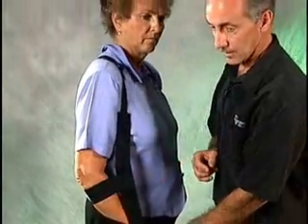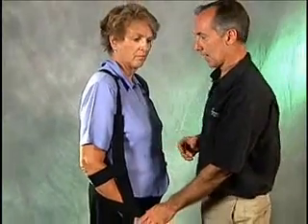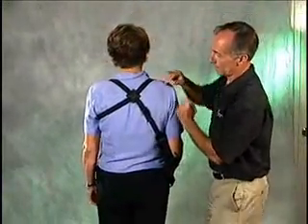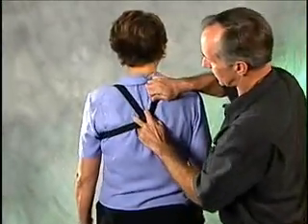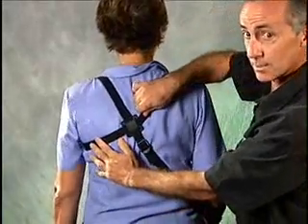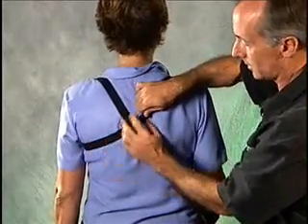You want to have 30 to maybe a little less than 30 degrees of flexion at the elbow. The four-tab buckle here — you want to have centered over the spine, and you want to take it down distal as far as you can. This really takes the pressure off the contralateral axilla.